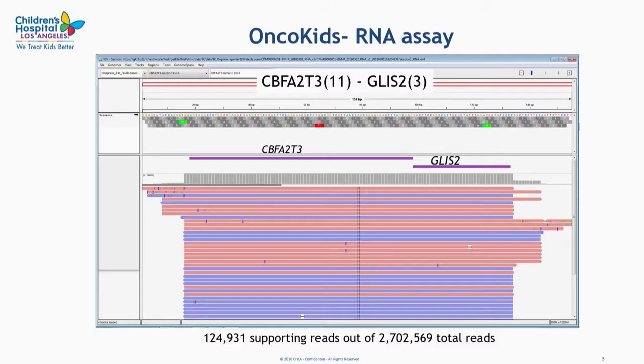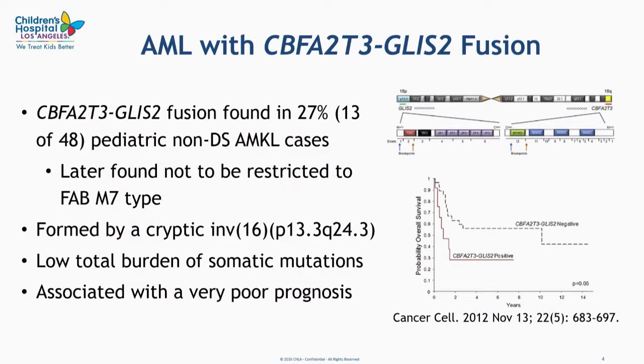Using our next-generation sequencing panel, in both these cases, we detected the same fusion, which is the CBFA2T3-GLIS2 fusion. What is seen on this slide is an IGV screenshot showing supporting reads that demonstrate the presence of this fusion.